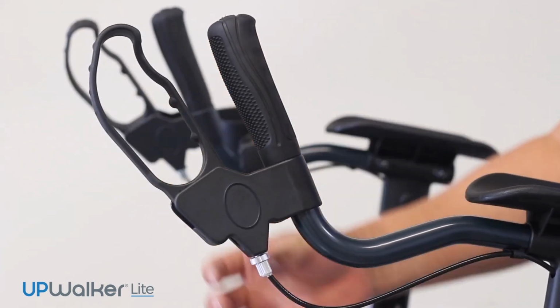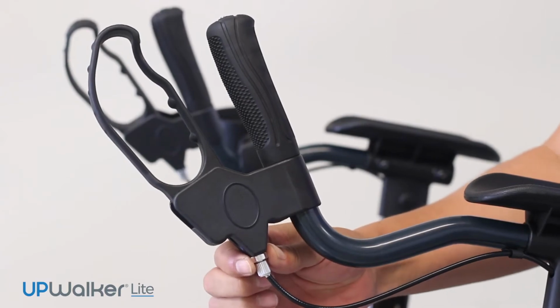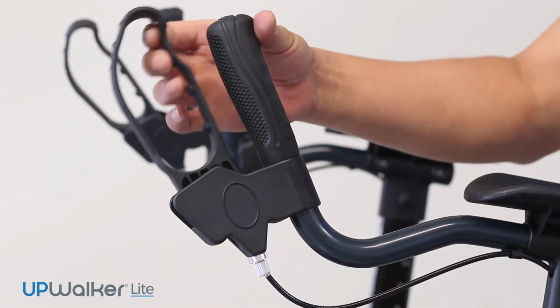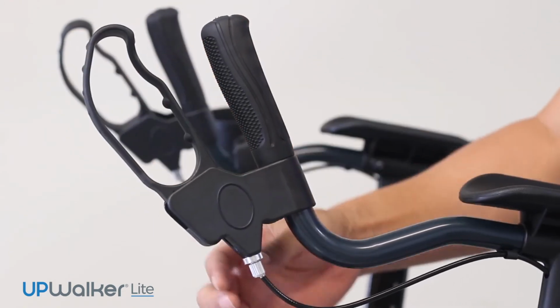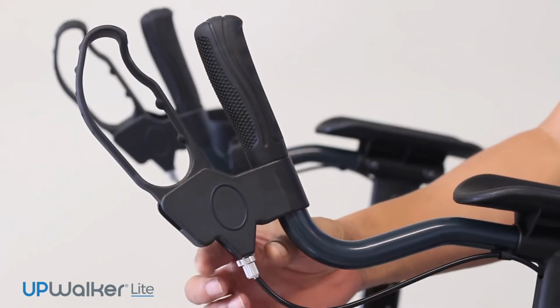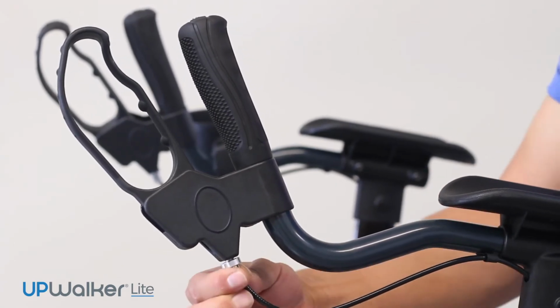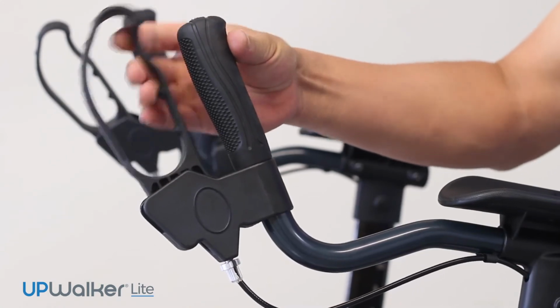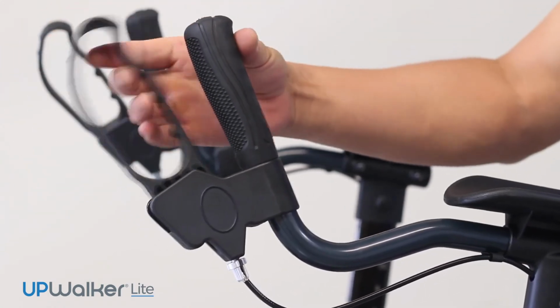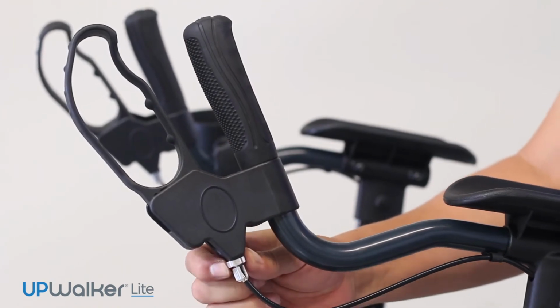If the brakes are too tight, use your fingers or pliers to turn the larger locking nut counterclockwise until loosened. Then use fingers or pliers to turn the barrel adjuster nut clockwise half a turn at a time until the brake functions as expected. Then turn the locking nut clockwise until it presses tightly against the housing of the brake handle to prevent the barrel adjuster nut from loosening.